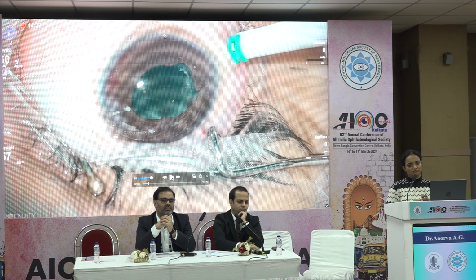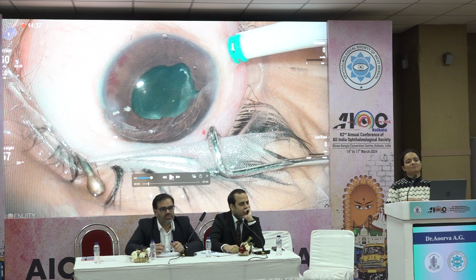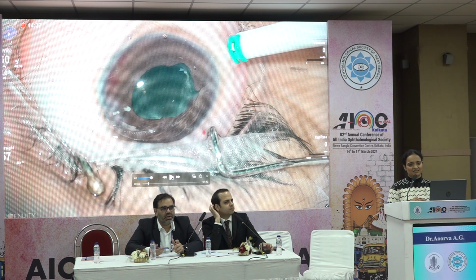The only take-home message is that if you are encountering such a case, before entering the trocar, UBM is not a practical solution. Once you have taken out the cataract, you could have self-indented, seen, and then put the trocar at the 6 o'clock position. You could have just changed your position, because if you touch it, then the eye is gone. If you create a break, then it's gone.